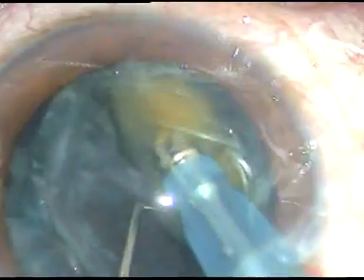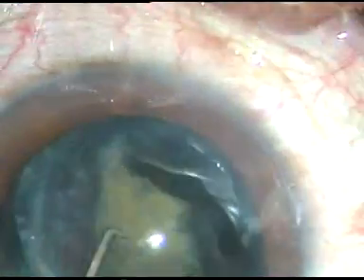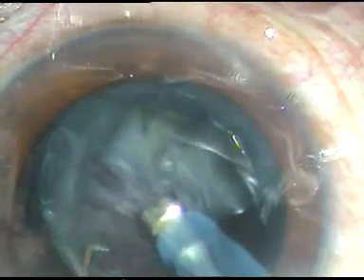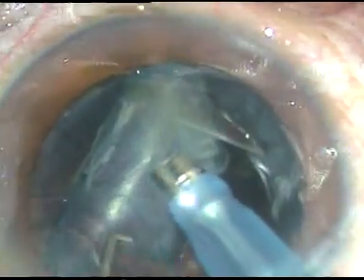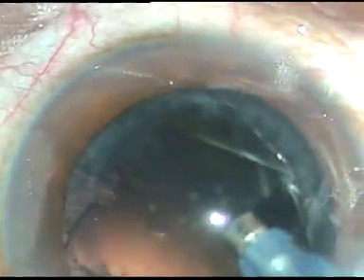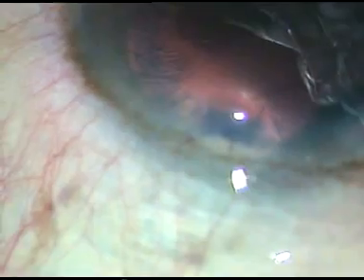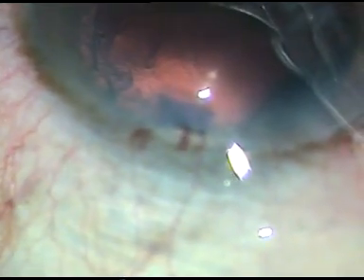This is the last piece, the last portion of the nucleus. The epinucleus is protecting the posterior capsule. Now the epinucleus is also removed. The anterior chamber was very stable and there was no risk of posterior capsular rent in this case.